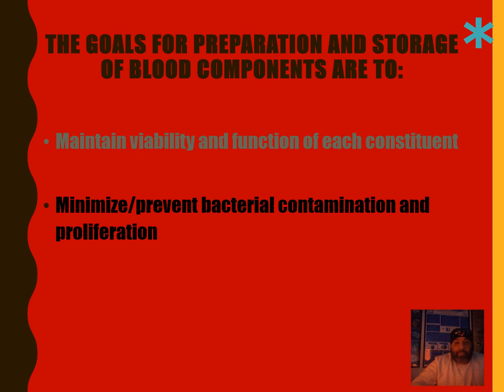One of the other goals for preparation and storage is to minimize and prevent bacterial contamination and proliferation. In manufacturing and processing departments that deal with red blood cell components on a mass level, preparation and storage allows them to ensure there is no bacterial contamination within blood that has been donated.